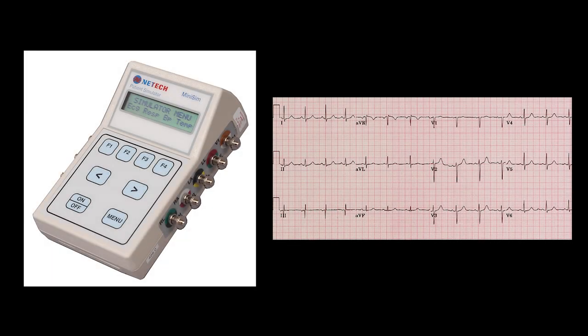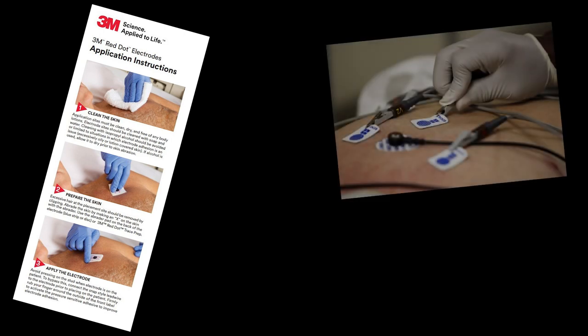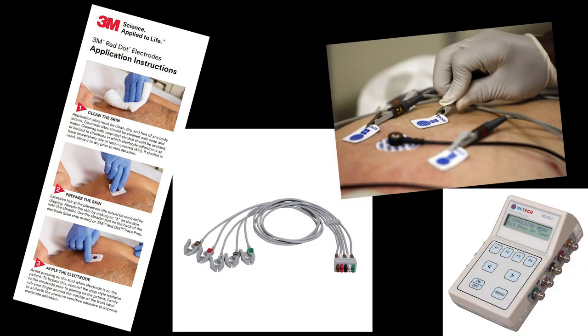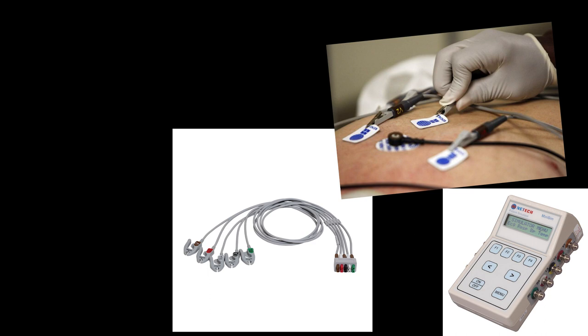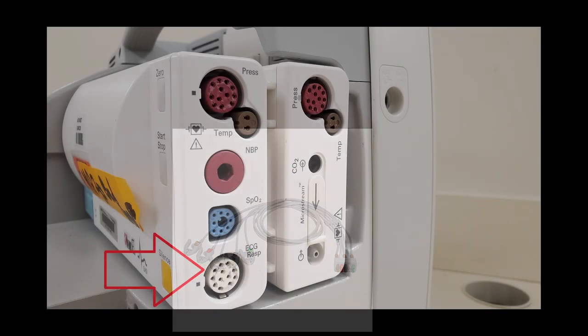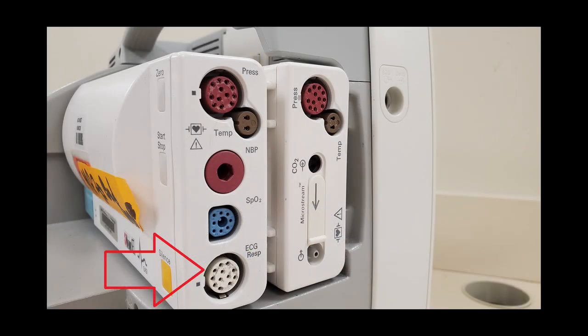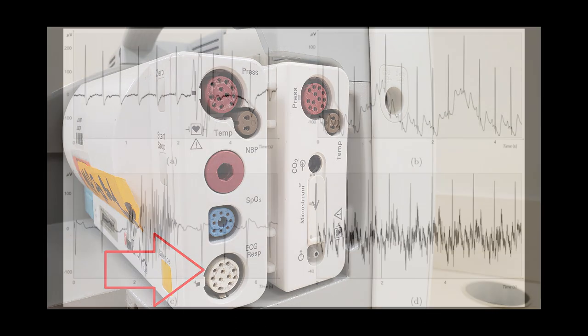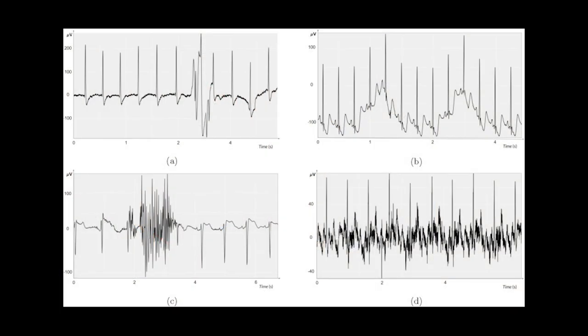Set your patient simulator to 60 or 80 beats per minute and examine the waves displayed on the patient monitor. If the signals are clear and constant, instruct the users to perform proper skin prep on the patient, reapply the electrodes, and use the cables you just verified on your analyzer. If the signal is not clear, then the problem is in the acquisition module or the ECG itself, and equipment replacement or repair is recommended.